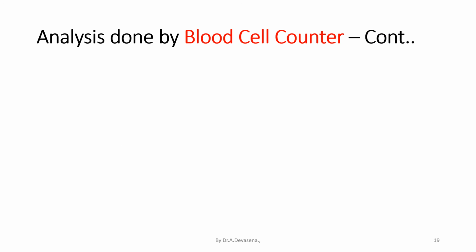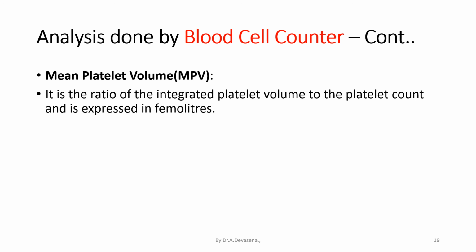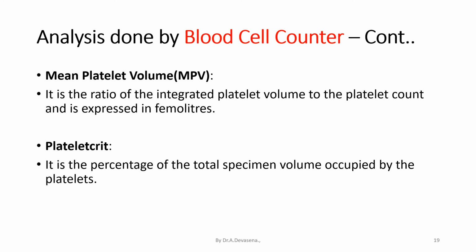Now we are going to discuss mean platelet volume, MPV. It is the ratio of the integrated platelet volume to the platelet count and is expressed in femtoliters. The next one is plateletcrit. It is the percentage of the total specimen volume occupied by the platelets.